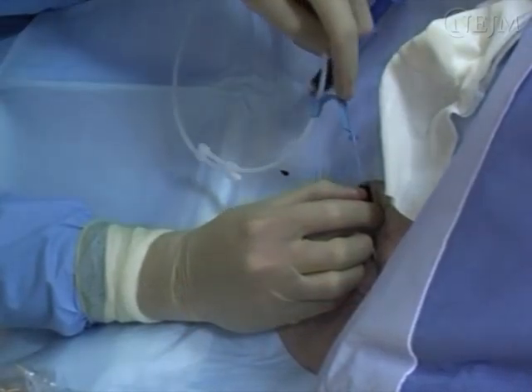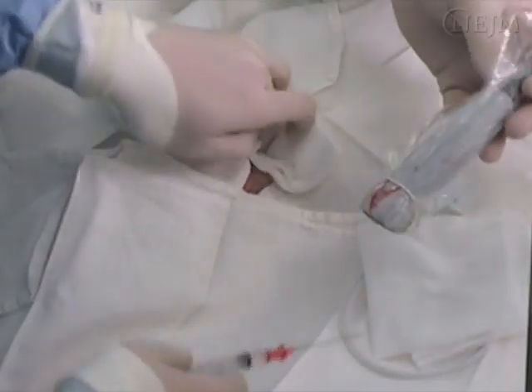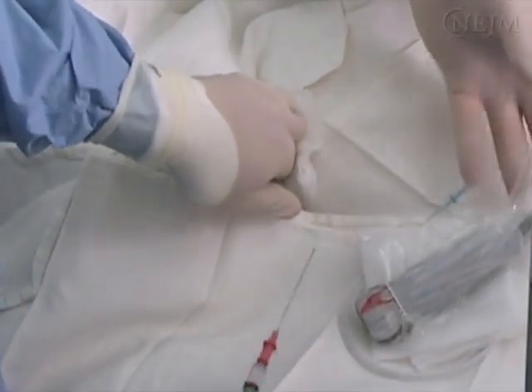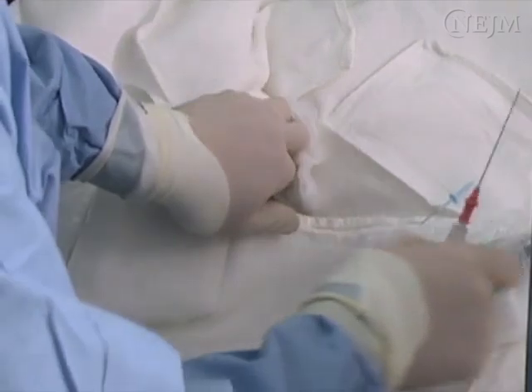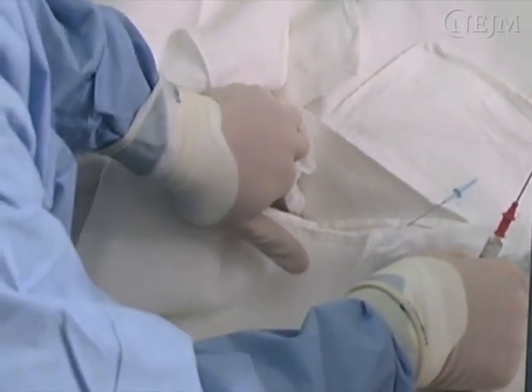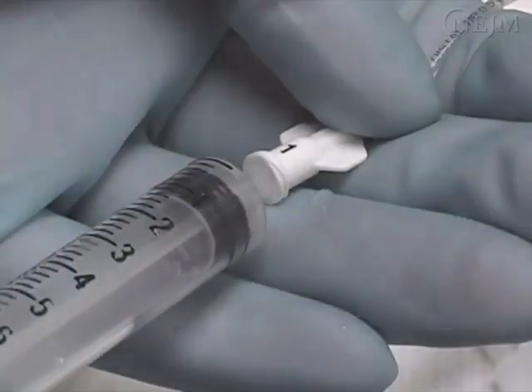Ideally, transduction should occur before the wire is passed and should be performed routinely. If arterial puncture occurs, remove the catheter and place firm, direct pressure on the site for 10 minutes or until there is no further bleeding.